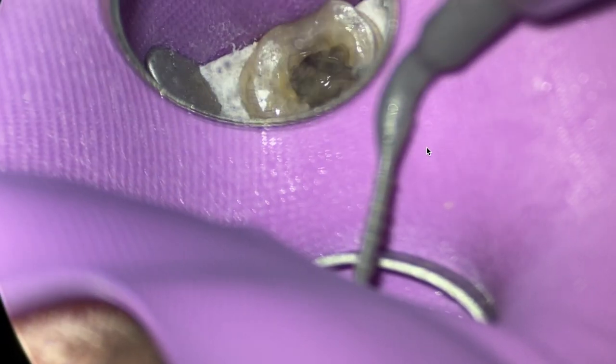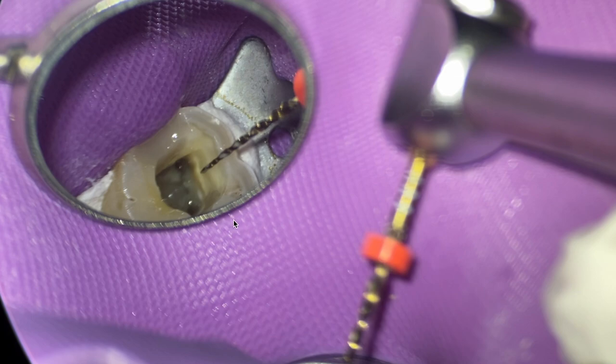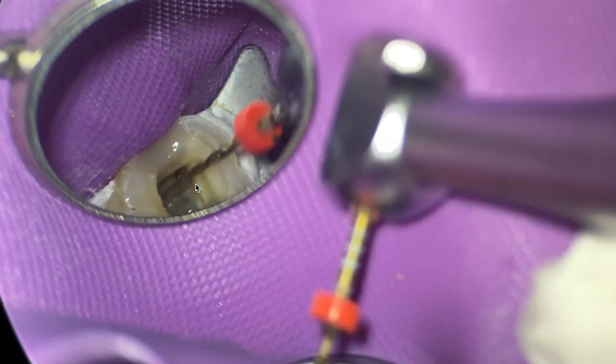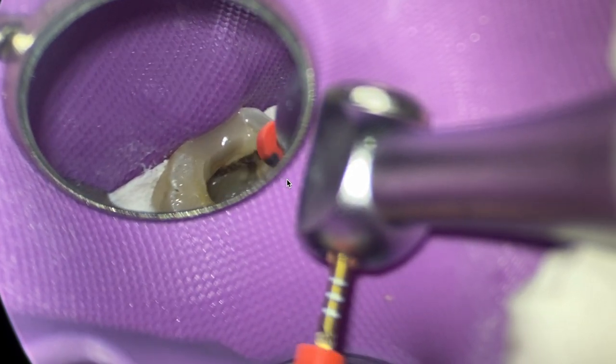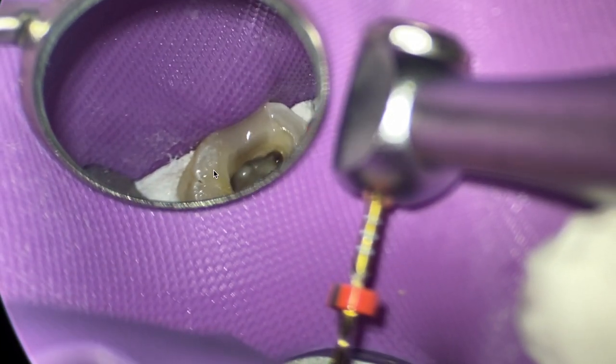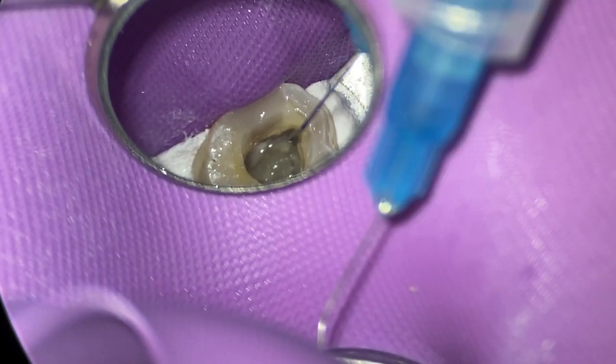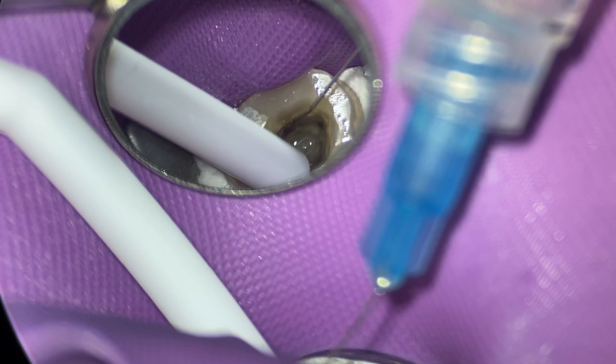I'll talk about a disinfection protocol real quick. It's pretty standard, just like everybody else, EDTA, sodium hypochlorite. But one of the things that people might not mention is that you can use EDTA to really get really close to your working length with your irrigating syringe and then irrigate all that debris out of there. It's really hard to get it. I'm chicken to get my irrigating syringe all the way down to my working length and be worried about a sodium hypochlorite accident. I'll use negative pressure irrigation sometimes. If you go ahead and take a look at our course, I'm not going to dry my canals before I try out my gutta percha points because I may have to go back in and clean and shape.